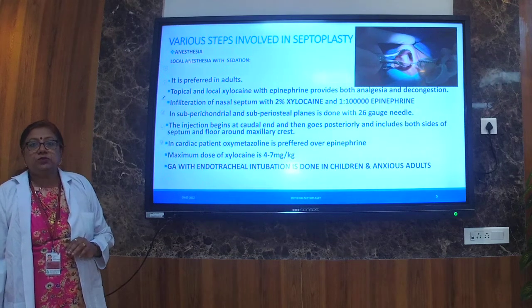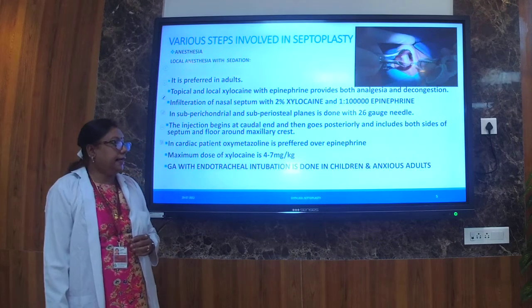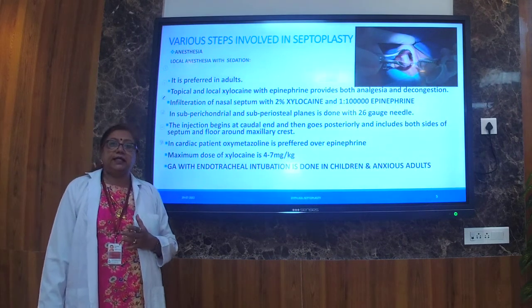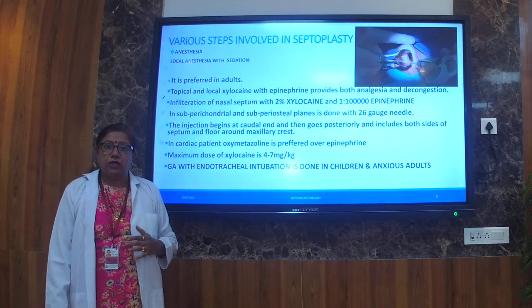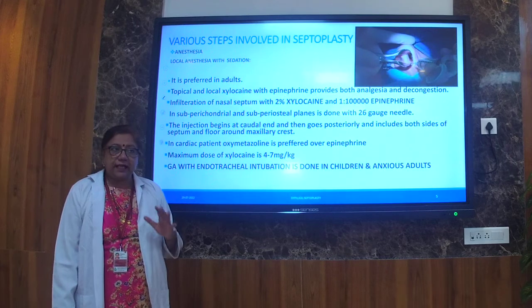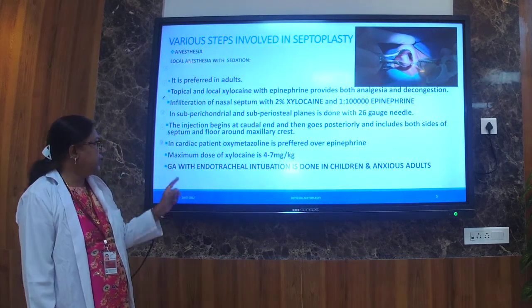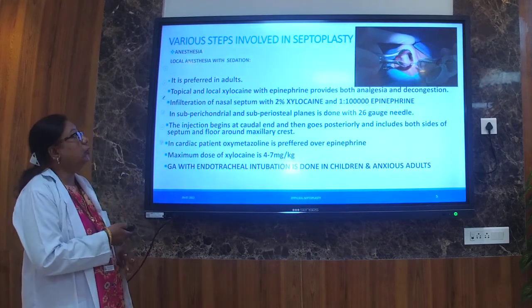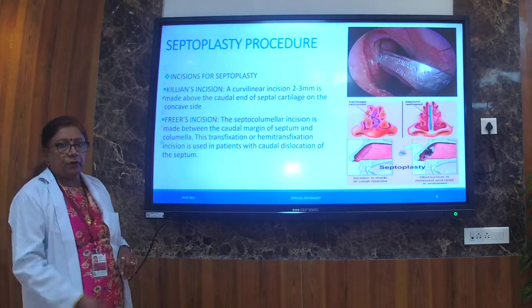Sometimes, if the patient is not cooperative, or if the patient is a child above 14 years of age and there is a severe nasal obstruction and we have to operate to relieve sleep apnea, in that case we use general anesthesia with endotracheal intubation. So these are the various steps involved in septoplasty.